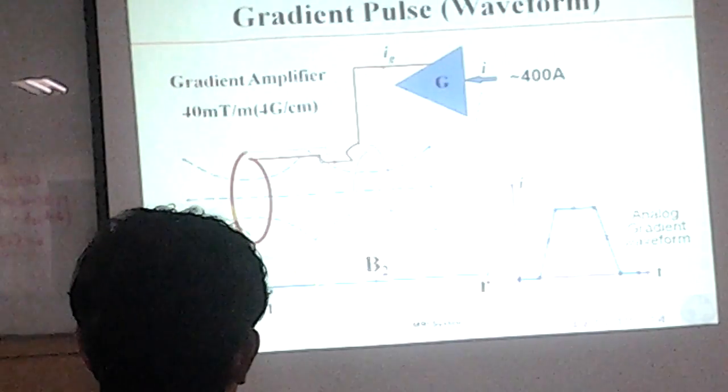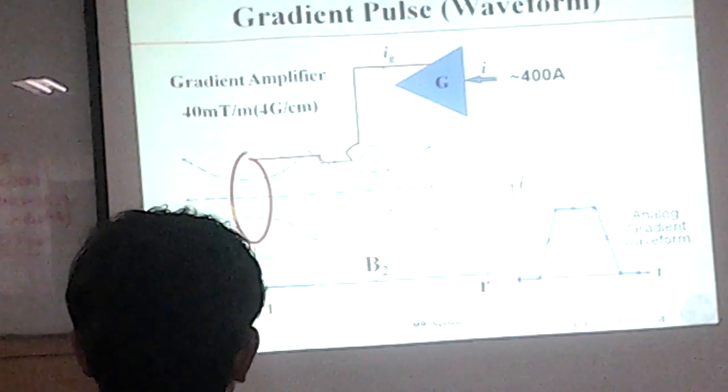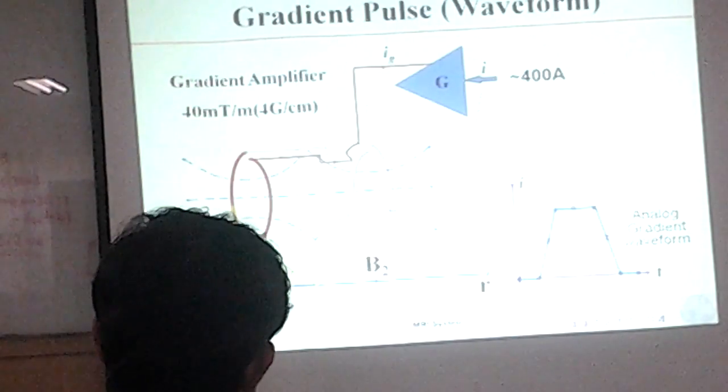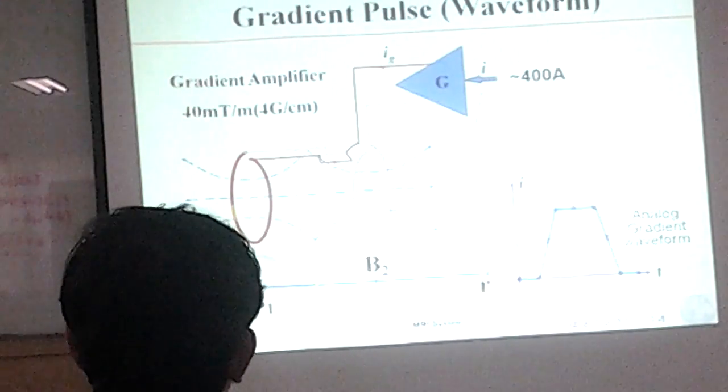During the transient time, the rising or falling time, the gradient is varying.